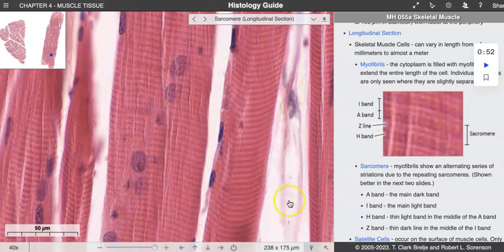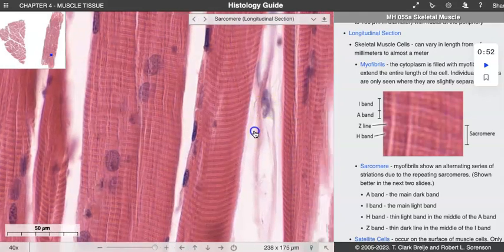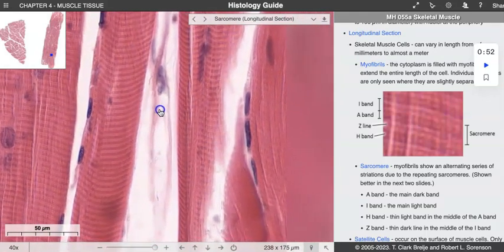There is a little bit of connective tissue in between the cells themselves, and this would be the endomysium that wraps around the outer surface of each skeletal muscle cell. We're looking at these in longitudinal form, so we really don't see the specific mysiums, the epi, peri, and endomysium, which we will head over and look at in a cross-sectional view. The connective tissue in between the cells also has fibroblasts, which would be making a lot of that protein fiber support.